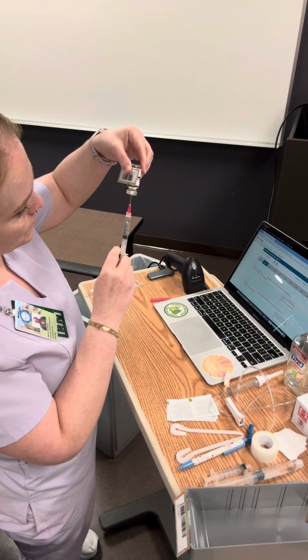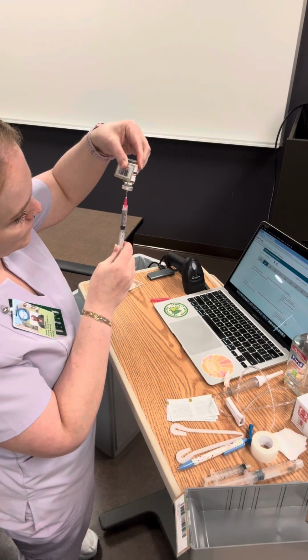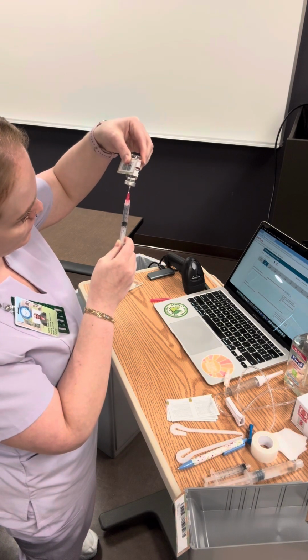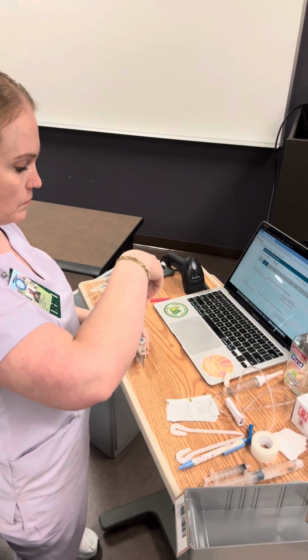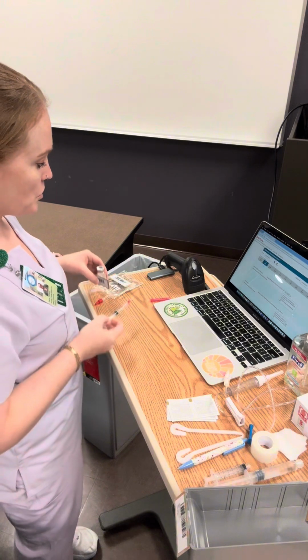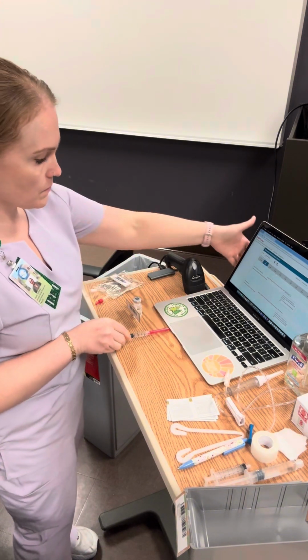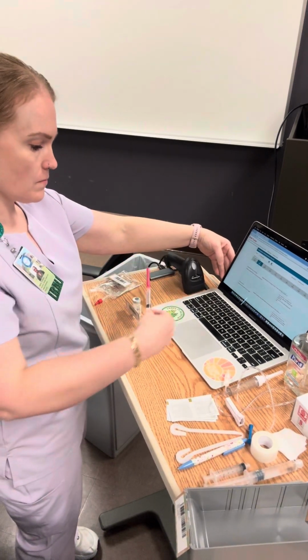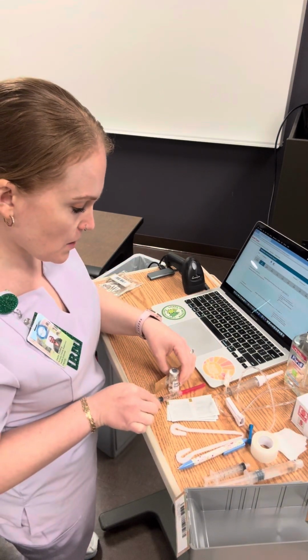Drawing up, adjusting as need be. So we are comfortable. Pulling this out, we're going to properly recap this needle. Okay, set that off to the side. This is ready to be given.